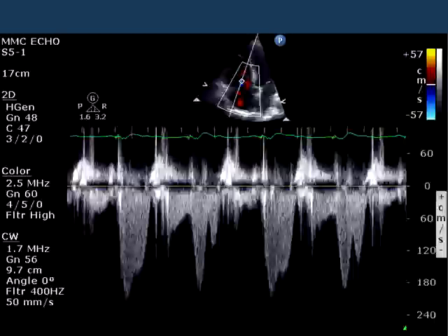If you look closely, you will see that it is, in fact, all of the above. I'm willing to venture that most echocardiographers don't come across a tricuspid regurgitation signal that looks like this quite so often, so I figured it might be fun to dissect this and see what's going on.